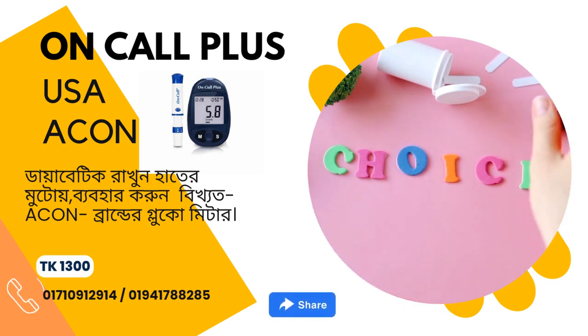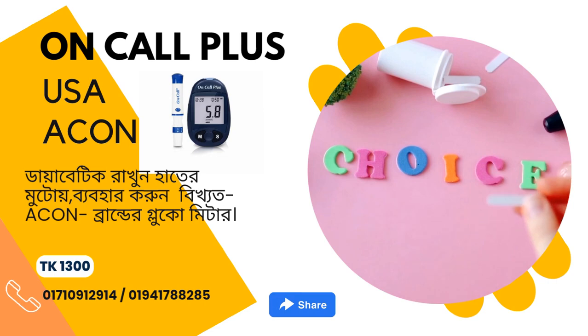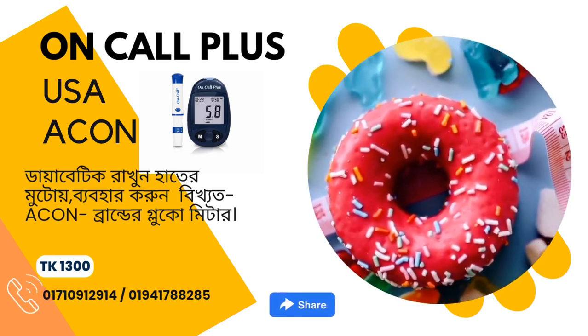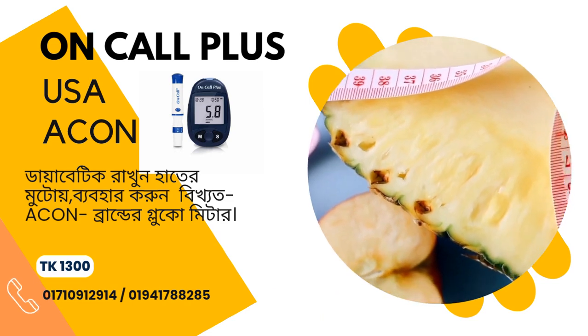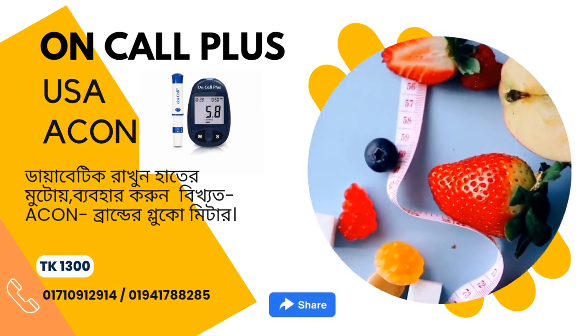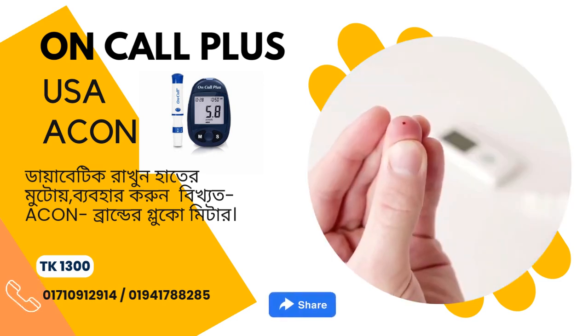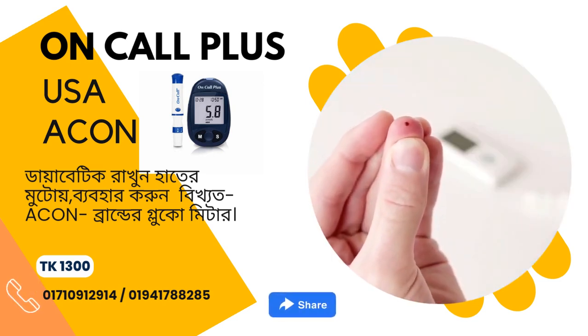Box contents: blood glucose meter, code chip, control solution, lancing device, clear cap for testing on forearm and palm, carrying case, user's manual, quick reference guide, quick start guide, warranty card, and logbook.